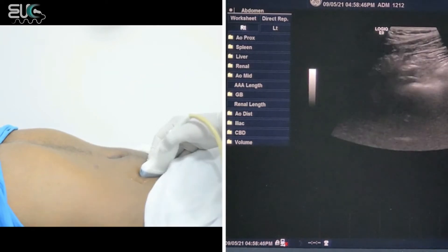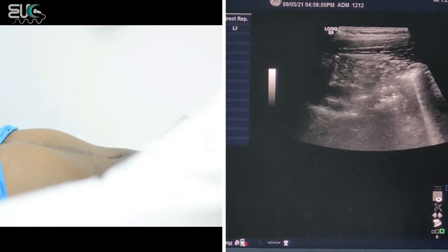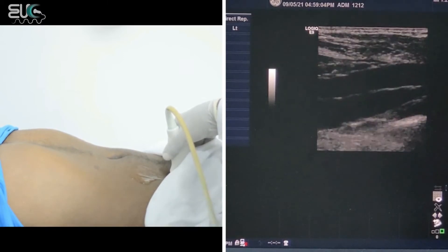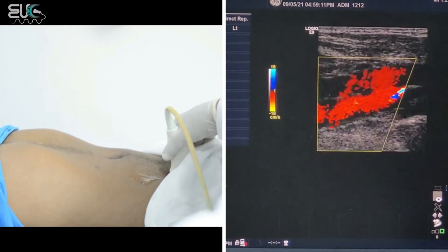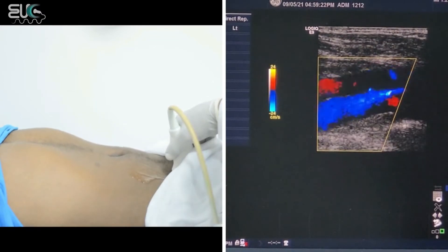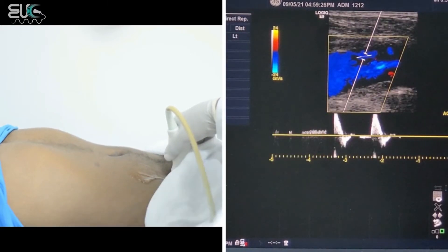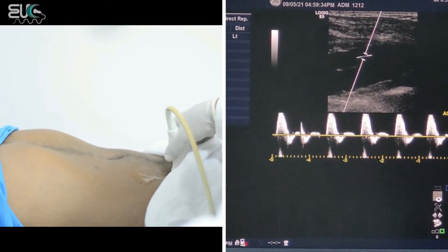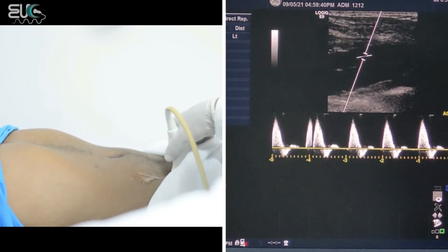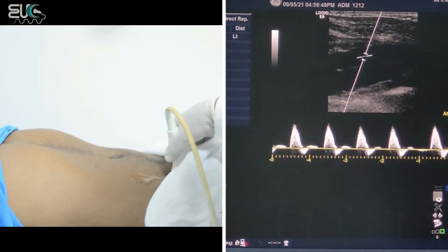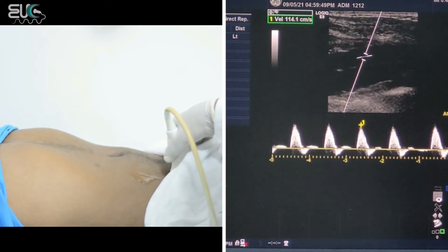In order to adjust the angle and make the waveform clearer, I will move to the linear probe, because with the linear probe I can steer the color box. Now I'm able to steer the box. I will move the baseline and increase the scale. Now we can see the waveform on the screen, which is a high-resistive, triphasic waveform with a peak systolic velocity of 100 to 140.